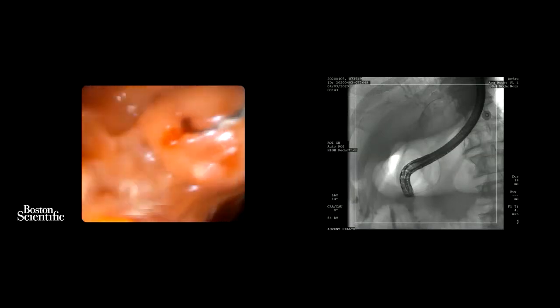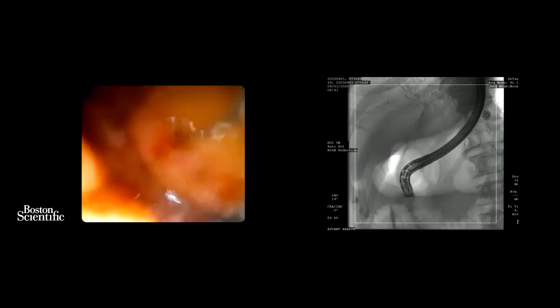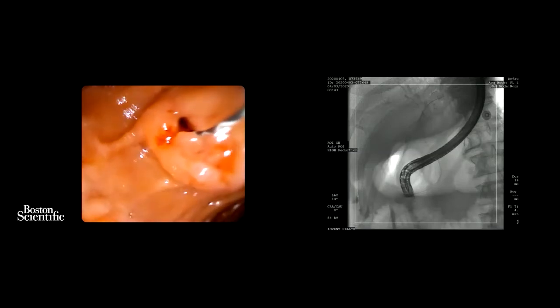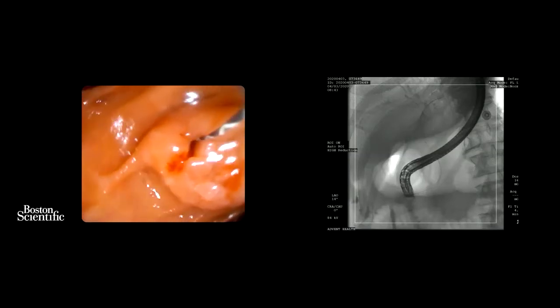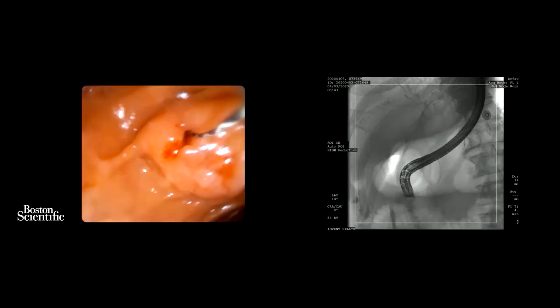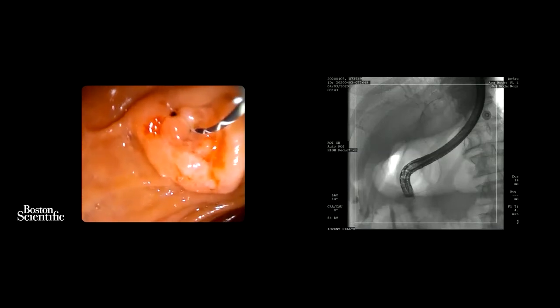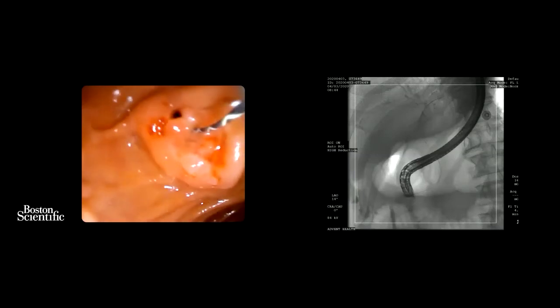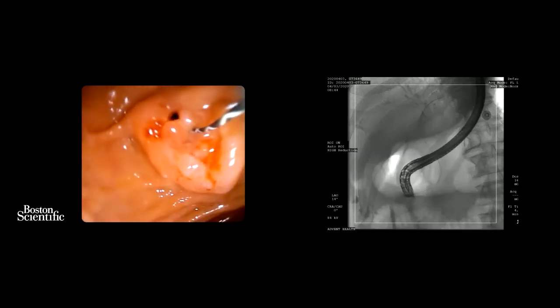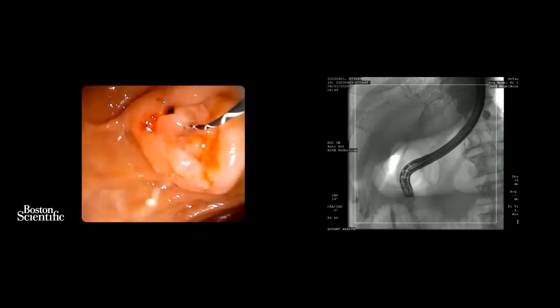And there were some viewers wondering whether you regularly do an EUS FNA for hilar masses and whether there is any concern for seeding and possible surgery candidacy. That's a good question. We do perform FNAs on hilar masses, but only when the patient is not a surgical candidate. So if you've got a very elderly patient with a lot of comorbidity, and we know that surgery is not a consideration, then the risk of seeding is actually overestimated. So we don't have a problem. But if it's going to be a young patient, or if there's a possibility of the patient being a surgical candidate, then we never perform a transduodenal or transgastric fine needle aspiration biopsy.